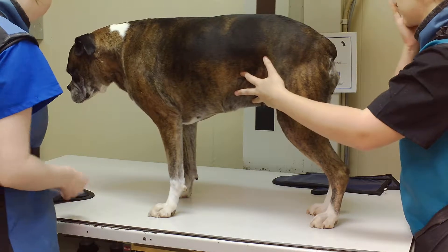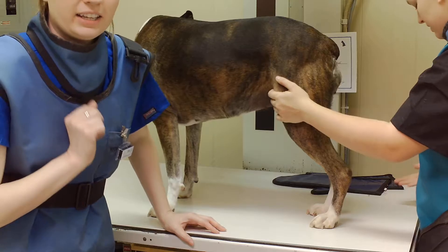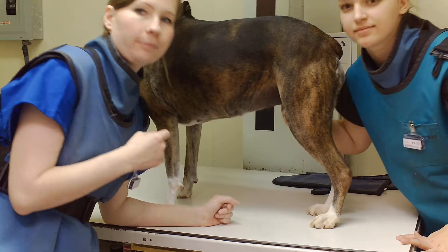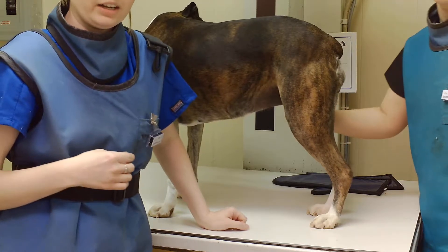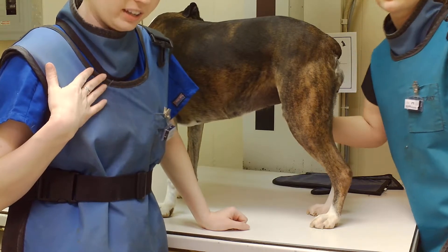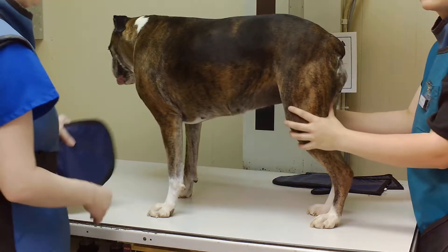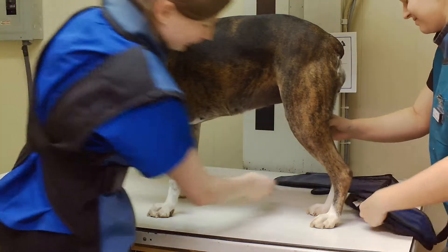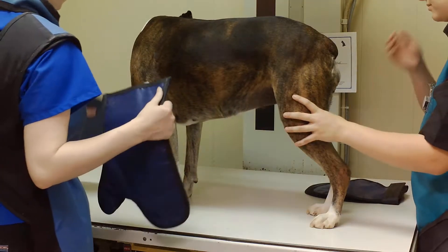We have our thyroid shields, our dosimeter badges, our lead aprons, and our gloves. We have our favorite pair of gloves.